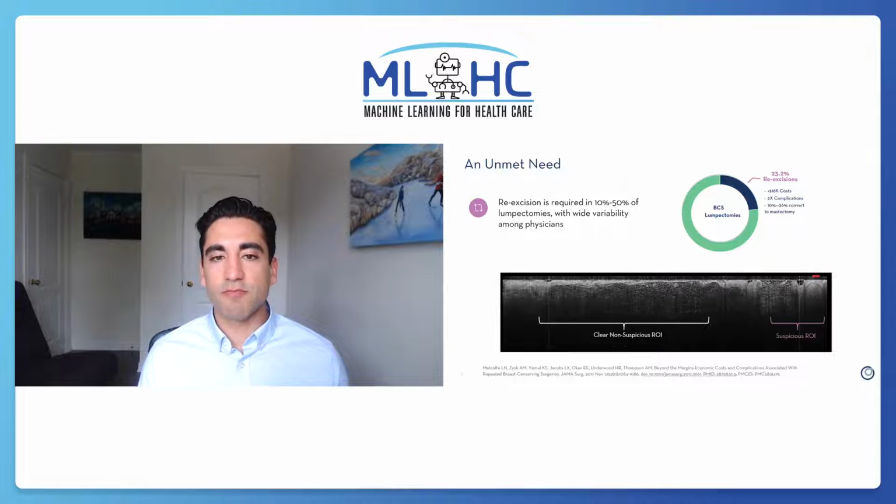Intraoperative evaluation of breast lumpectomy specimens using wide-field OCT may aid in visualizing these microstructures to help achieve clear margins at the time of primary surgery and improve patient outcomes. This presentation will go over how we have leveraged AI methods to correctly identify these suspicious features in OCT images.